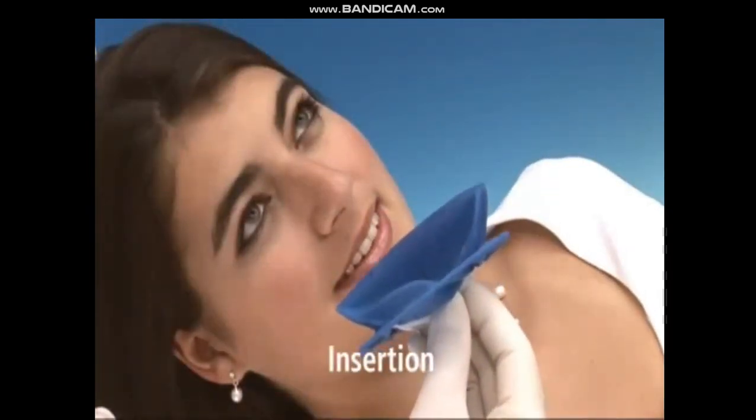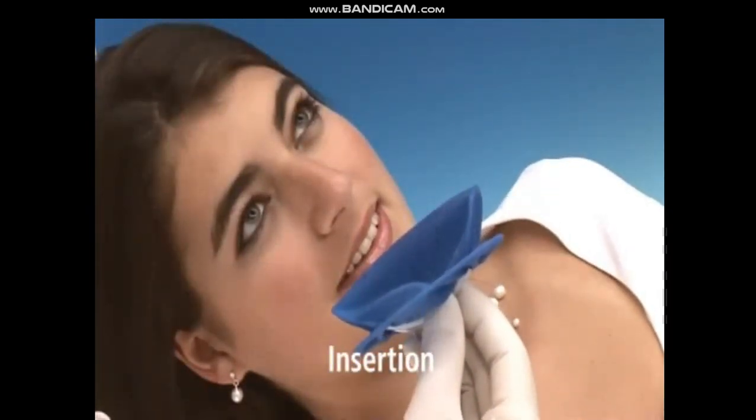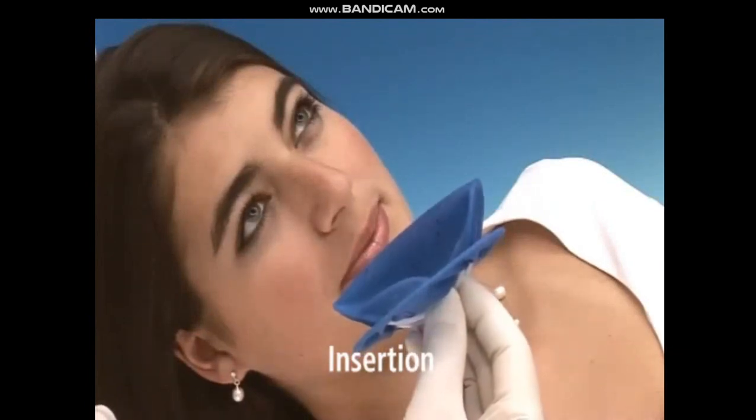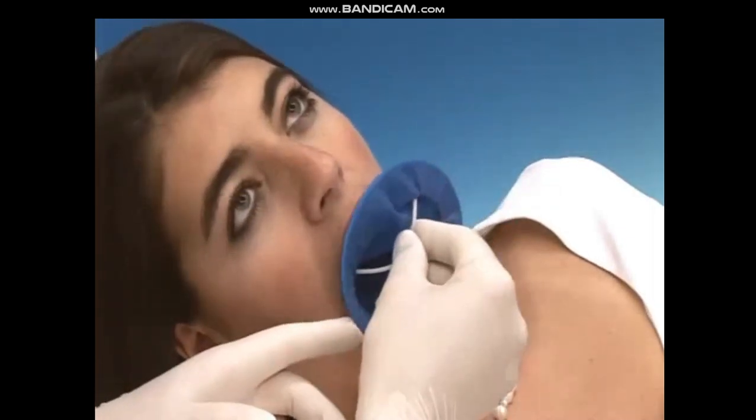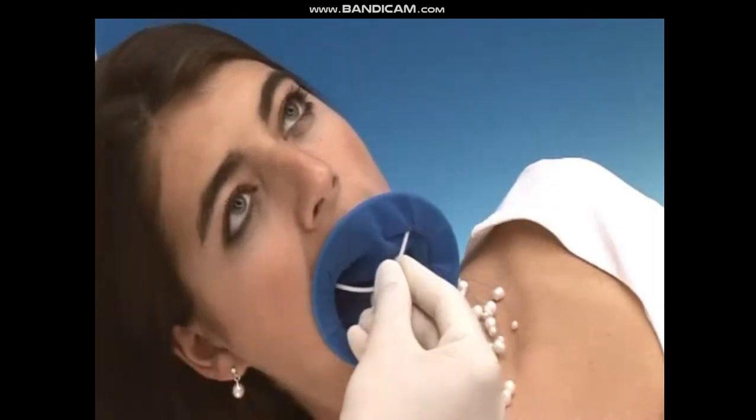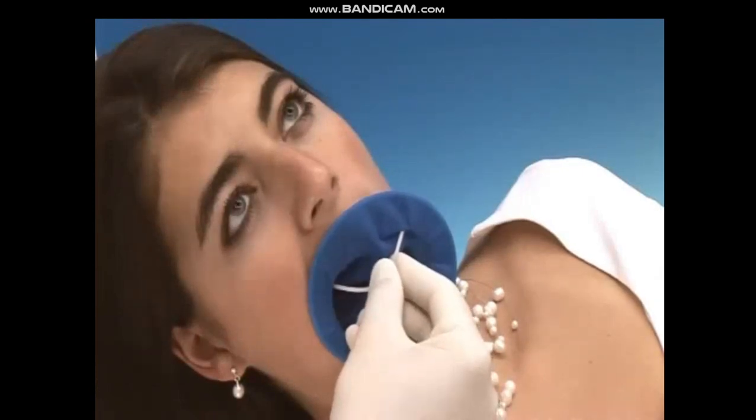Now the dam can be placed in four simple steps. During the first step, one of the two wings is placed as deeply as possible behind the first corner of the mouth. If this first placement is not deep enough, you will run out of space when placing the other side.